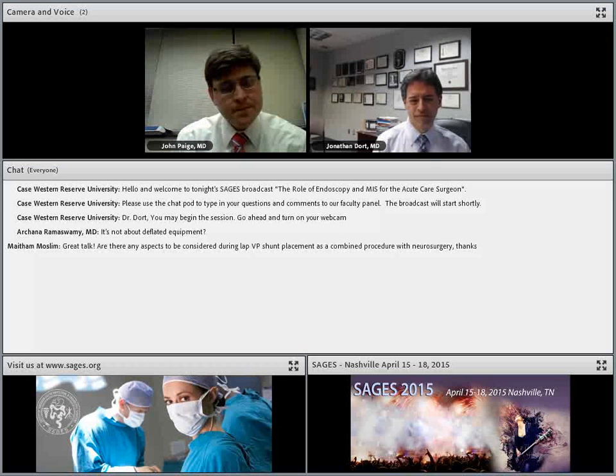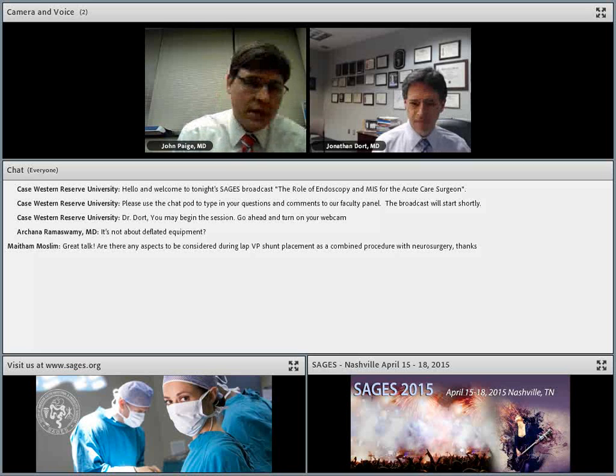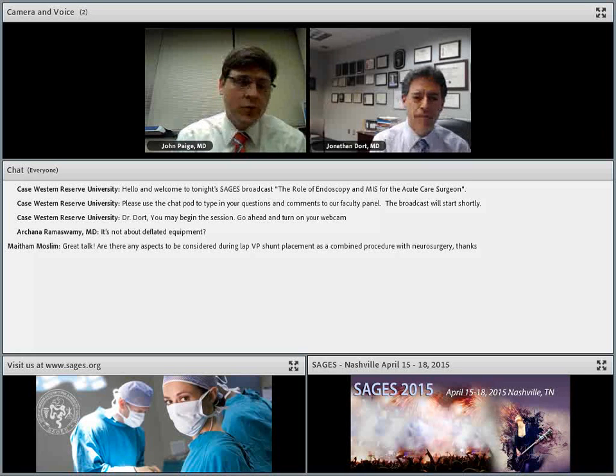I would just be aware that you're putting the shunt to decrease the pressure, and positioning would be an important component, and to avoid Trendelenburg. I think if you put the head up a little bit, that might help, if you're still able to get the access you need in the abdomen.